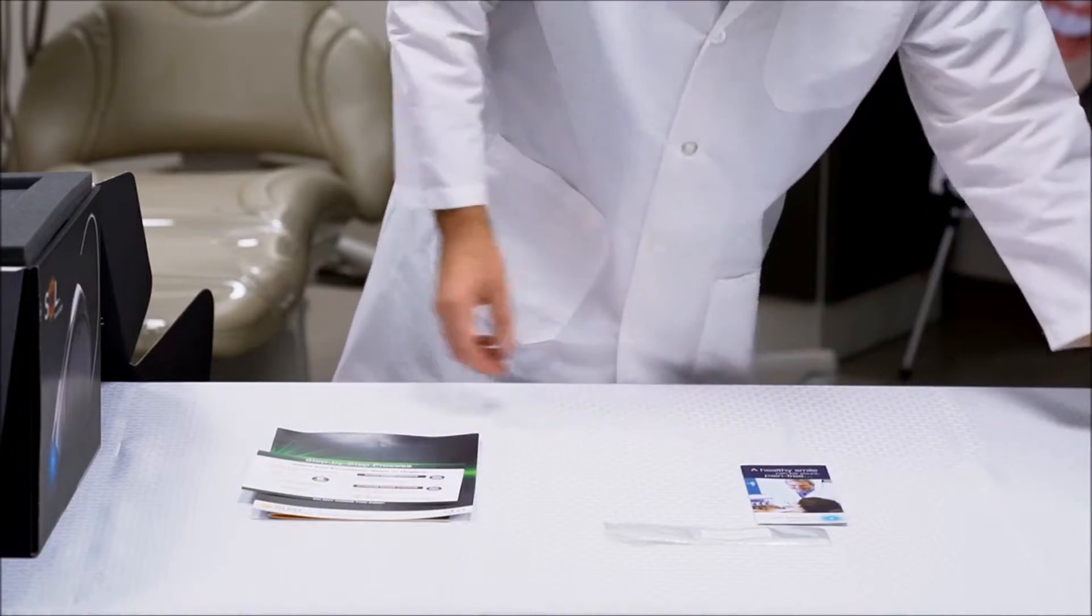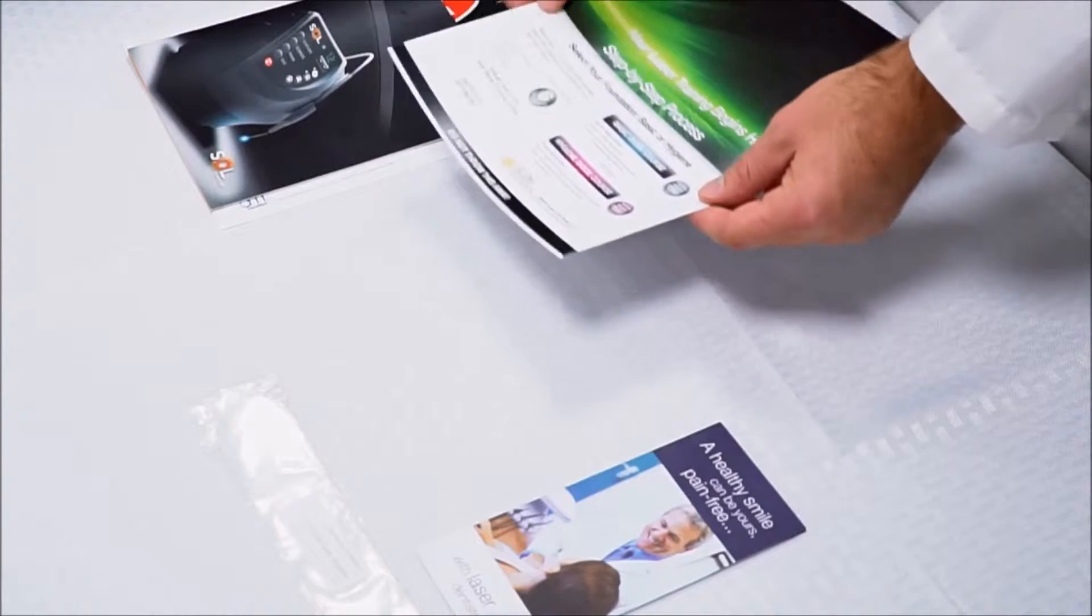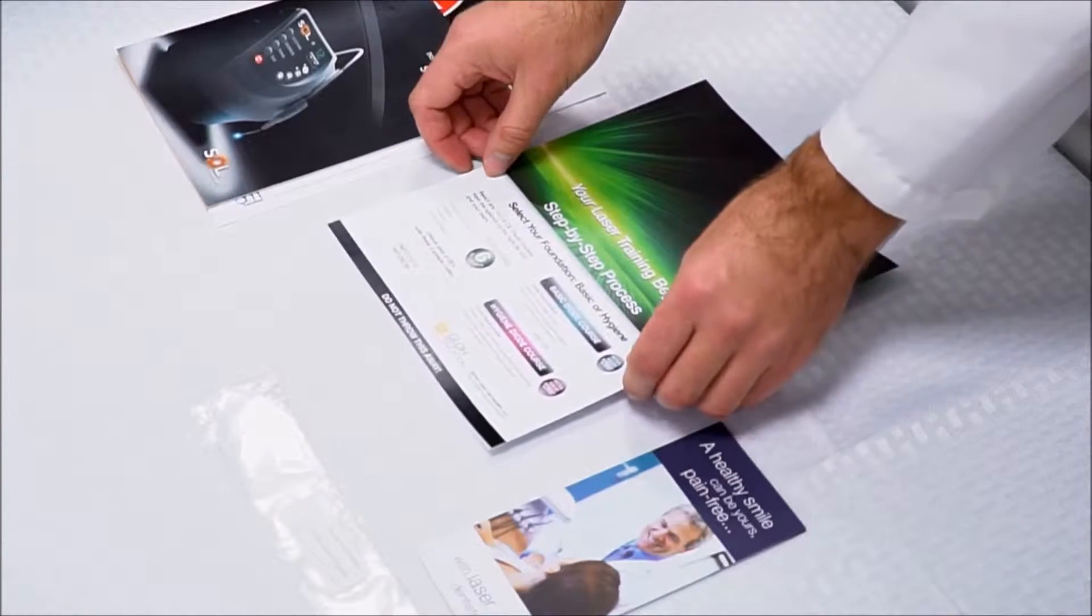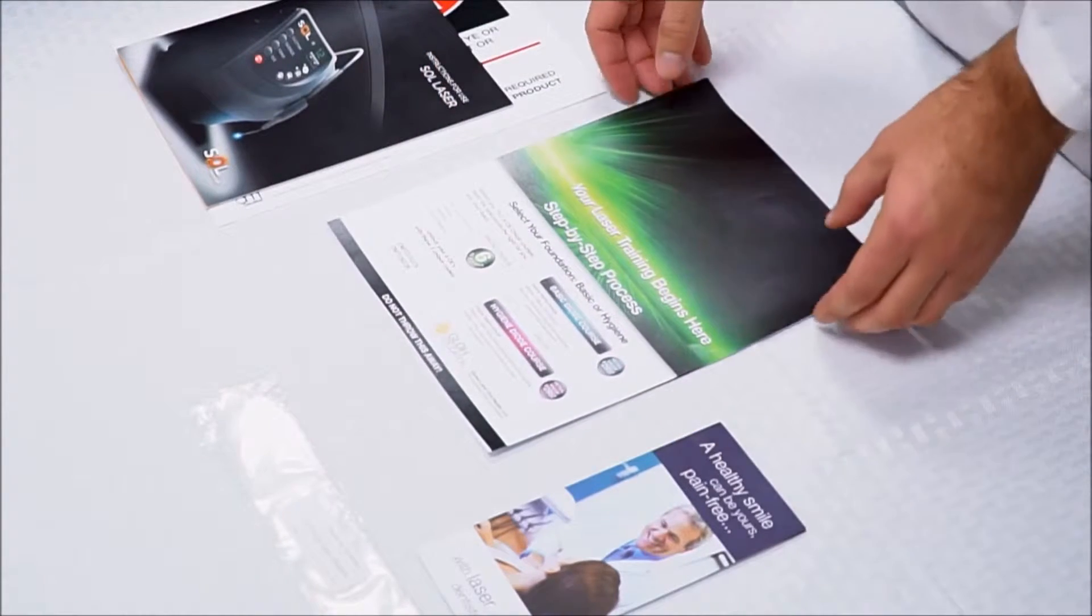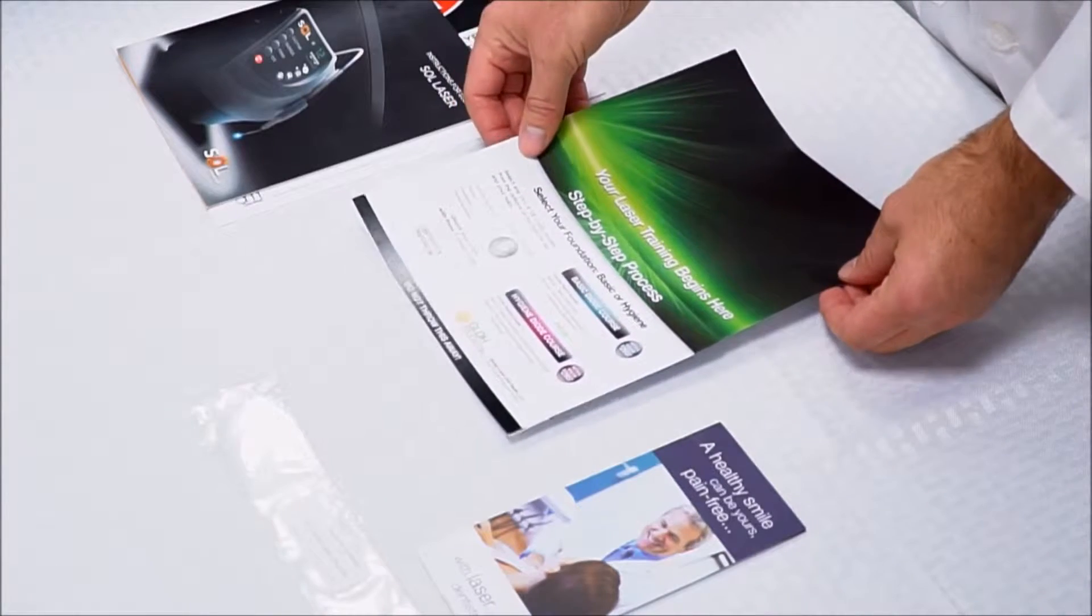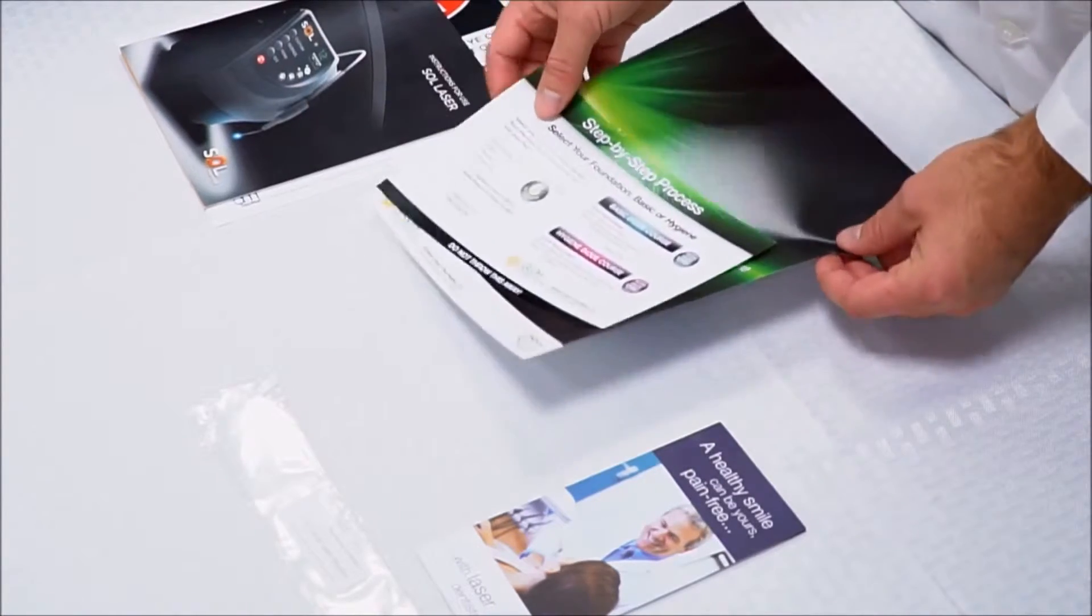At Denmat, we also include an online laser training. So if you or any members of your staff would like to do an online CE training, we do have some options for you here. There's a brochure as well.